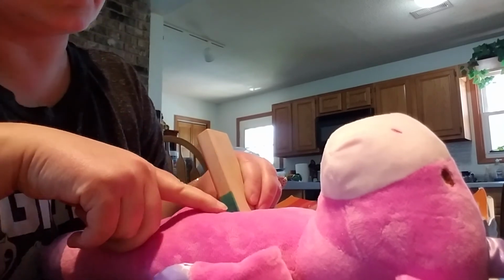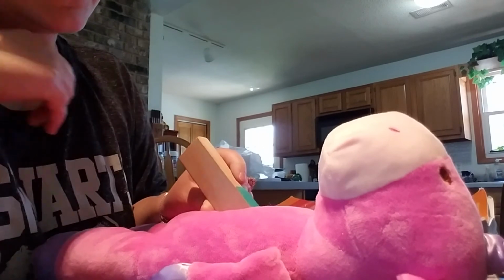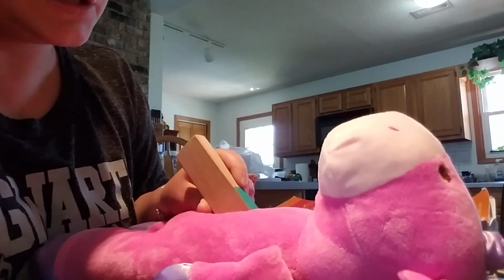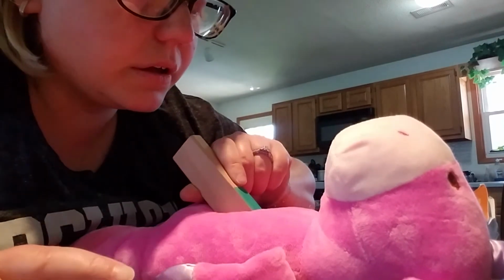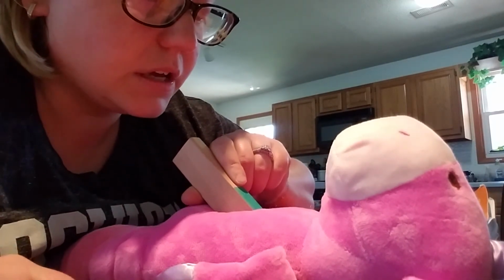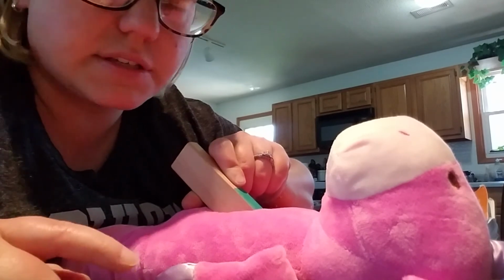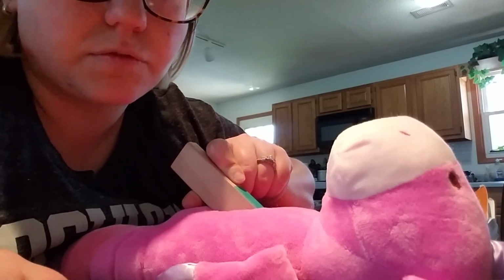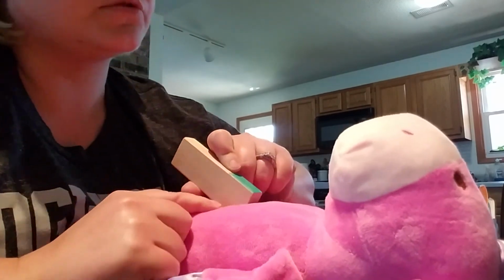You're going to turn your indicator to 12 o'clock, push in and superiorly to view your IVC. You're going to do color in your IVC. You're going to take a diameter measurement of your IVC, and you're going to do the sniff test with your patient to check for collapsibility of your IVC. And then you're going to move on to the suprasternal notch.